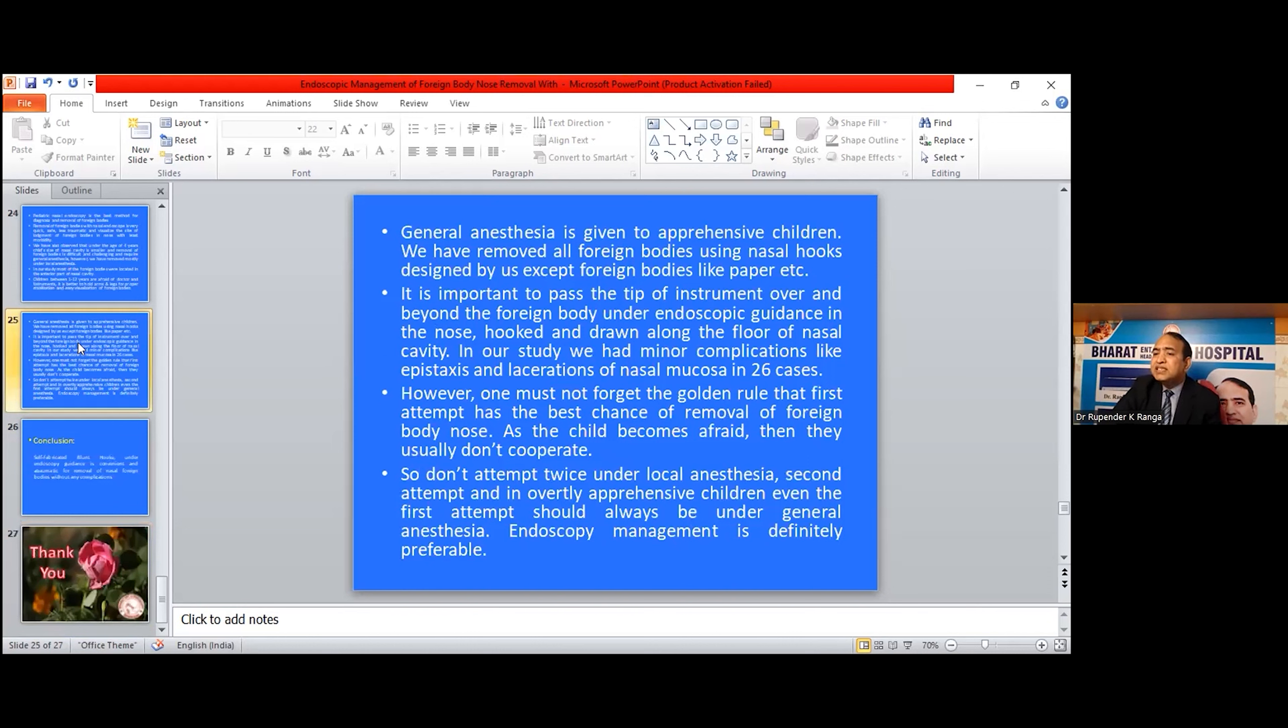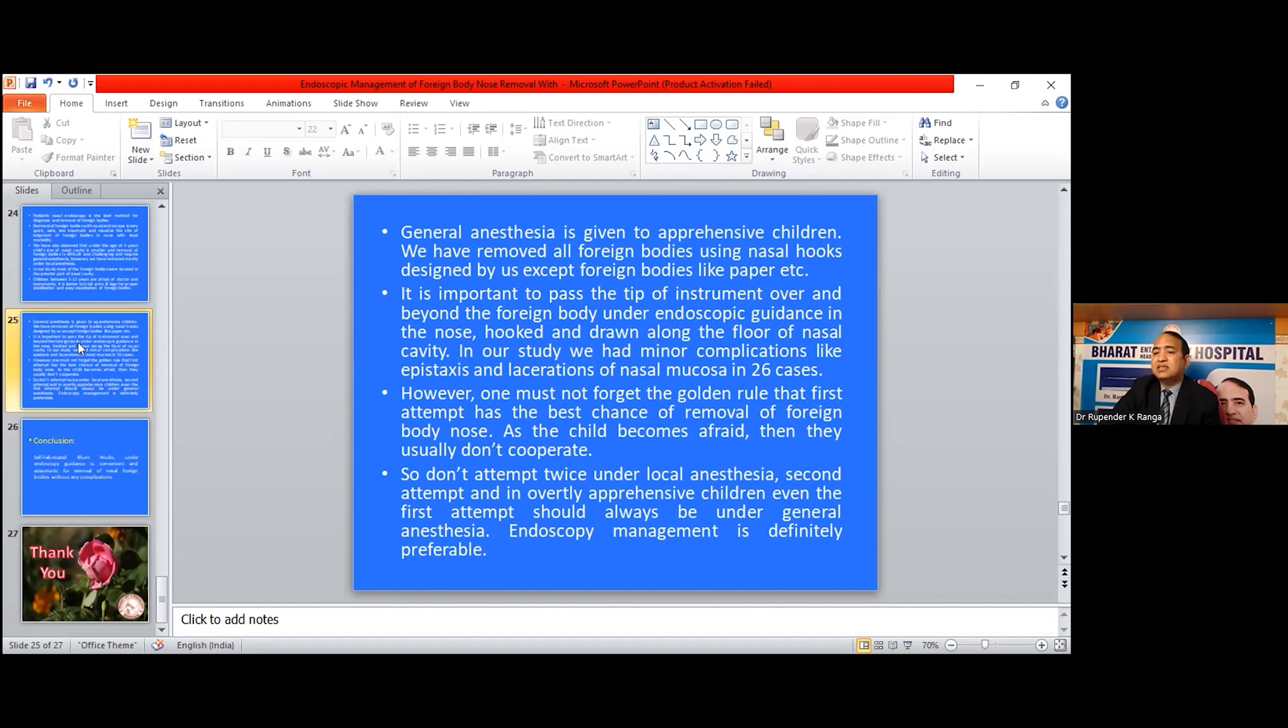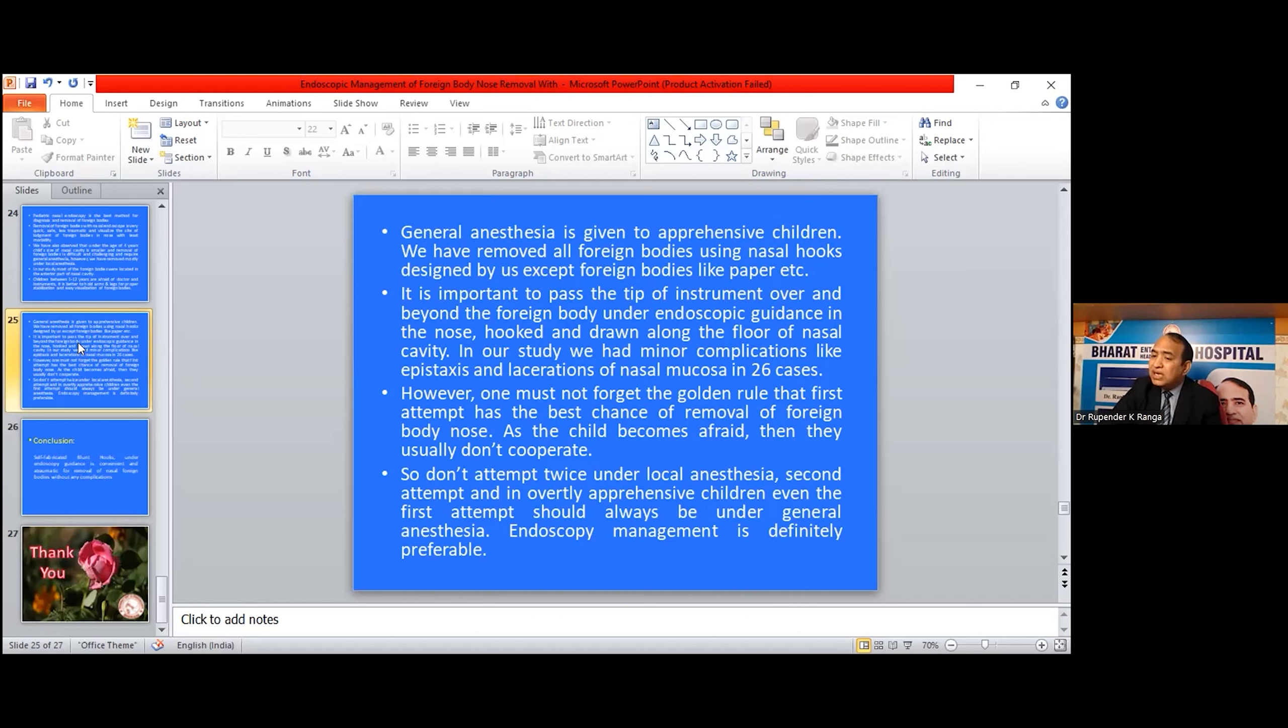General anesthesia is given to apprehensive children. We have removed foreign bodies using the nasal hook designed by us except for foreign bodies like paper. It is important to pass the tip of the instrument over and beyond the foreign body under endoscopic guidance in the nose, hook it, and draw it along the floor of the nasal cavity. In our study, we had minor complications like epistaxis and laceration of nasal mucosa in 26 cases. However, one must not forget the golden rule that the first attempt has the best chance for removal of foreign bodies in the nose. As the child becomes afraid, they usually don't cooperate. So don't attempt twice under local anesthesia. Second attempts and overtly apprehensive children, even first attempts, should always be under general anesthesia.